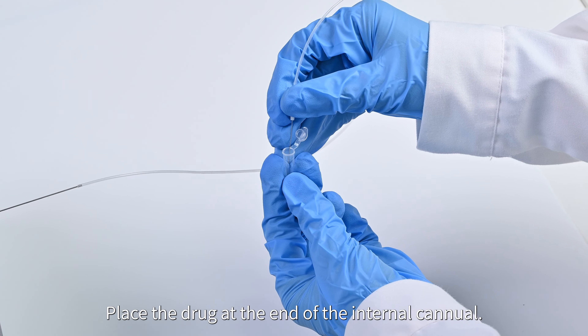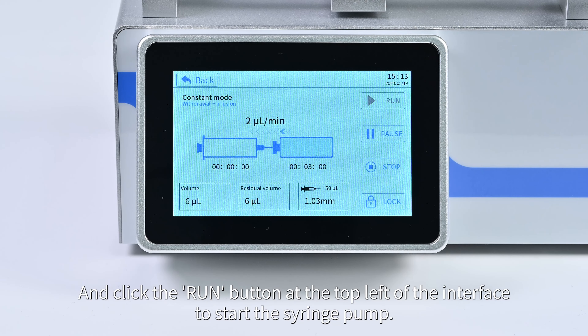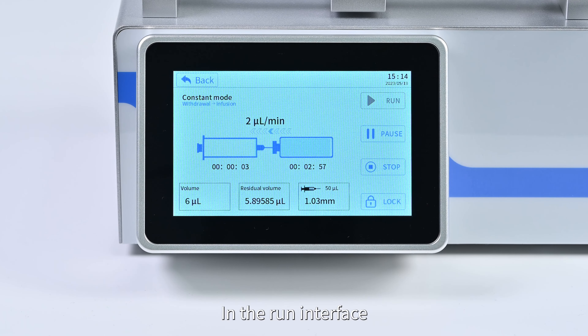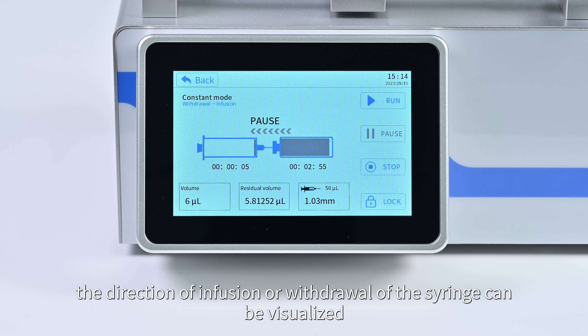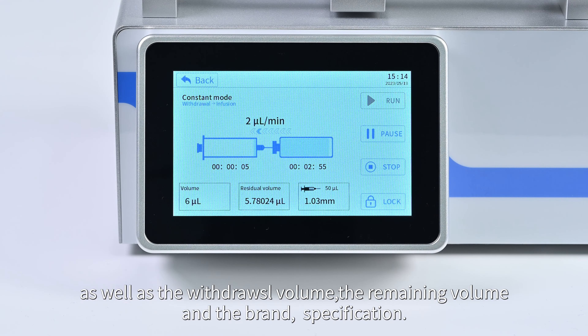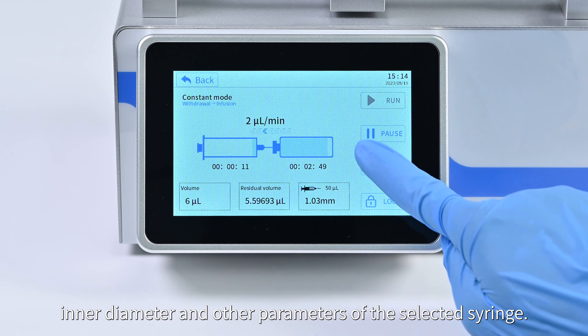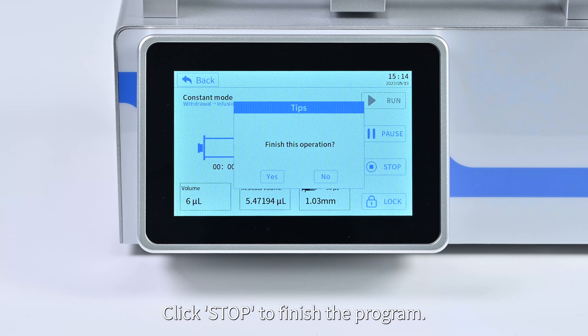Place the drug at the end of the inner cannula and click 'Run' at the top left of the interface to start the syringe pump. In the run interface, the direction of infusion or withdrawal can be visualized, along with the injected/withdrawn volume, remaining volume, and the brand, specifications, inner diameter, and other parameters of the selected syringe. Click 'Stop' to finish the program.